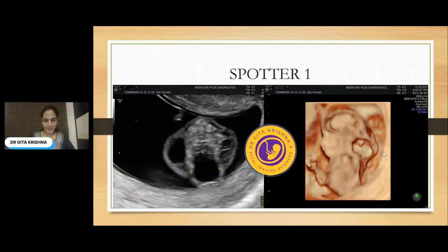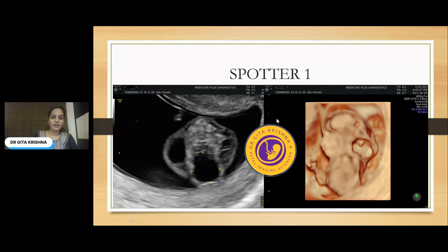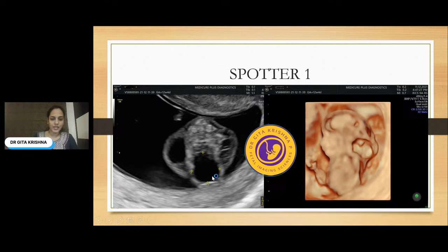Here is the first case. This is the 2D as well as 3D image. This fetus is around 12 weeks, and there are three cystic structures on both sides of the neck, as well as in the posterior aspect of the neck. This was the 3D image that we took. What is the diagnosis?